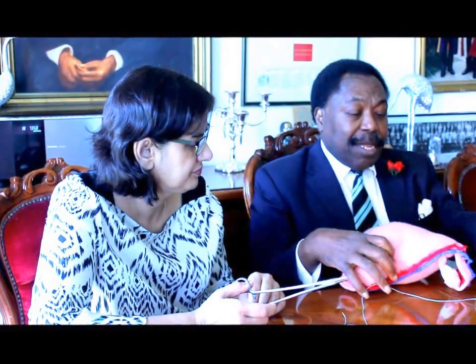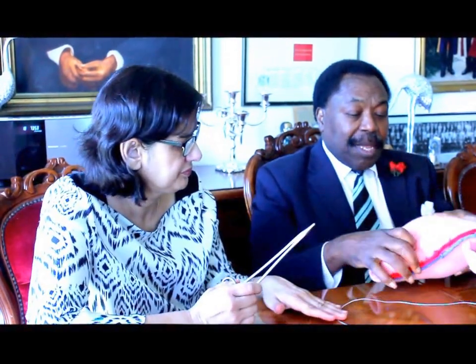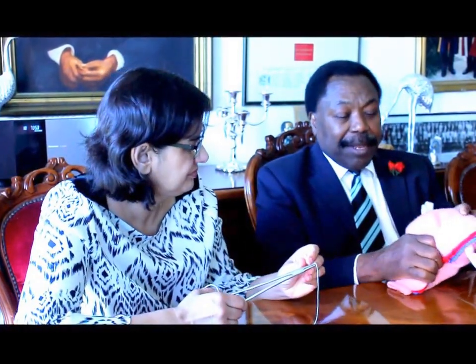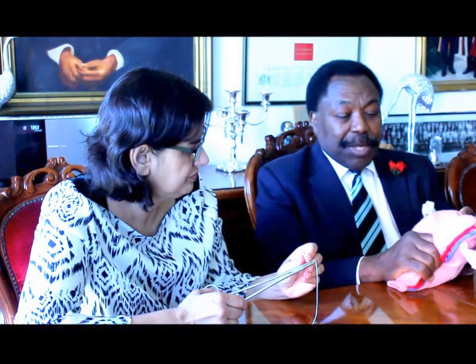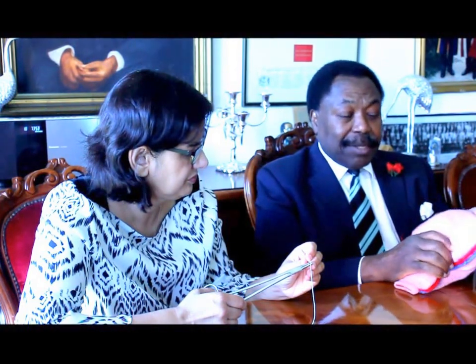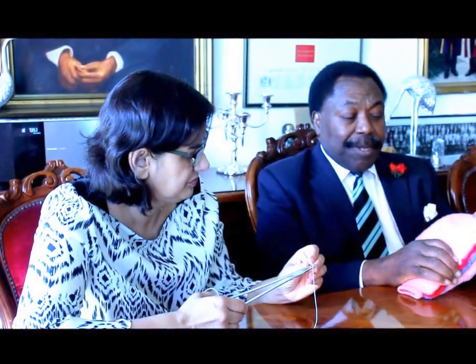The first thing we do is establish compression bimanually, with an assistant between the legs of the patient, to ascertain that bleeding is controlled. This is to test the compliance of the suture effectively.